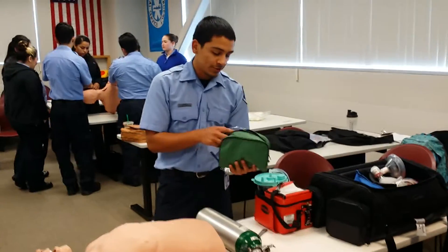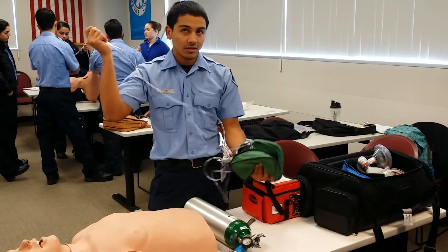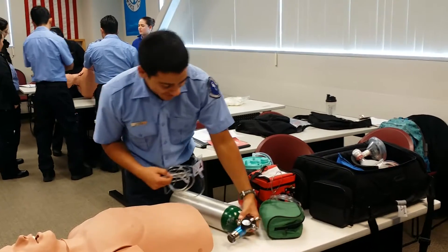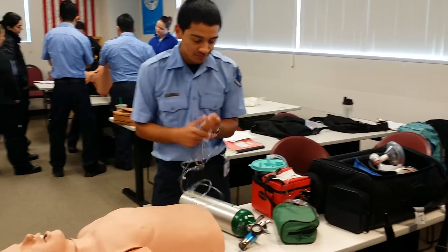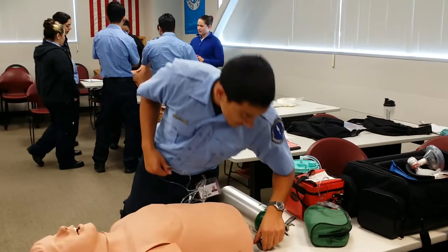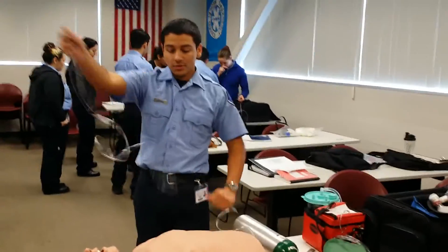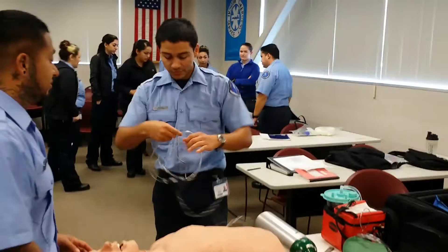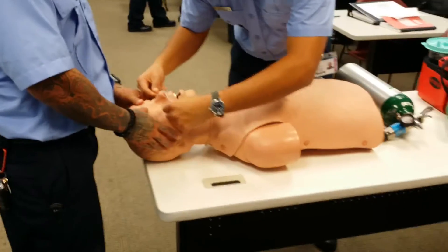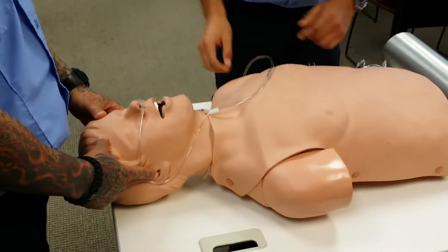The nasal cannula range is two to six liters per minute. I'm going to set it at six. Make sure I feel flow coming out. Make sure there's no kinks. So now I'm going to go ahead and place it — prongs in the nose, behind the ears, and cinch it. Not too tight, not to choke him.